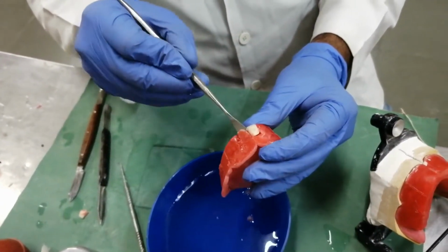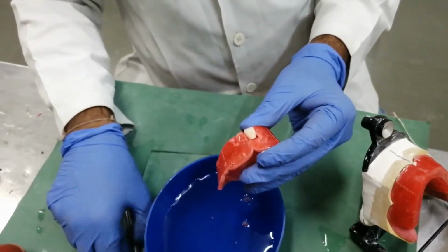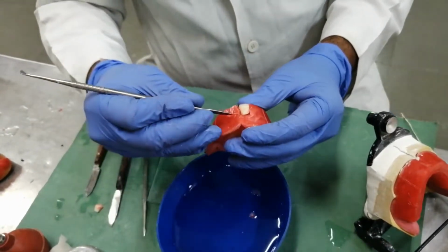Now for securing midline, we are going to put another central incisor. For that, we are making another socket.